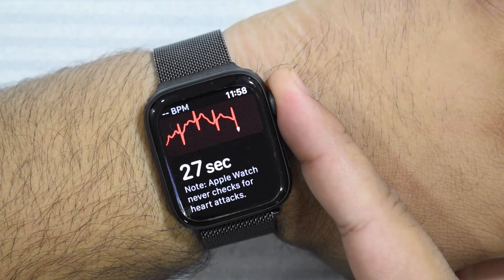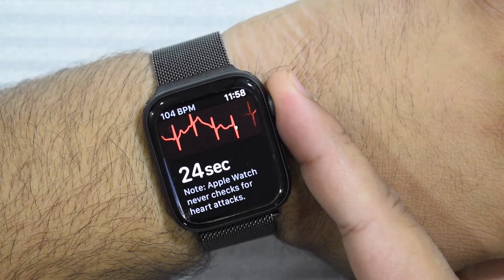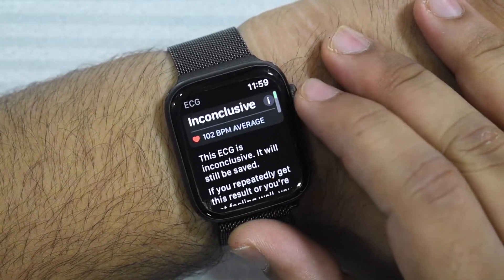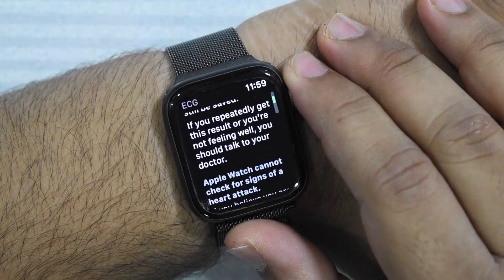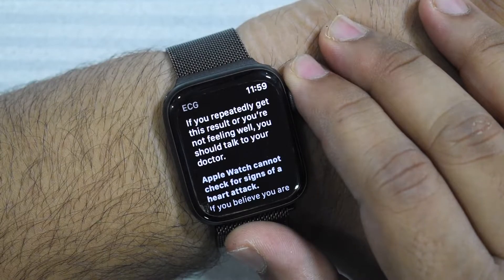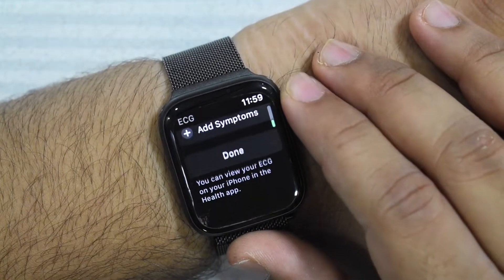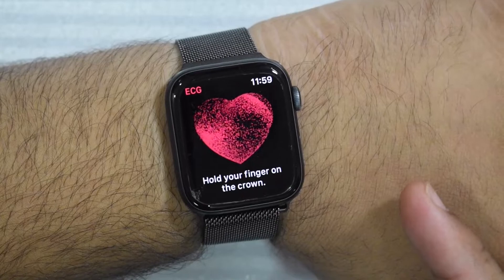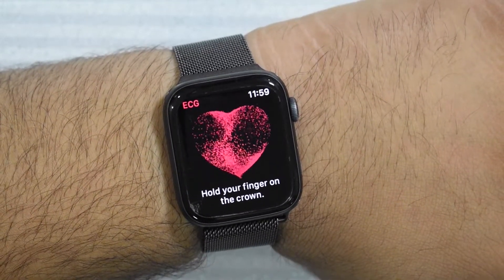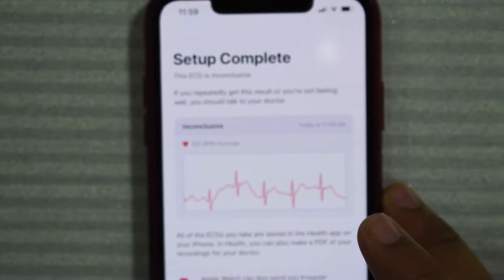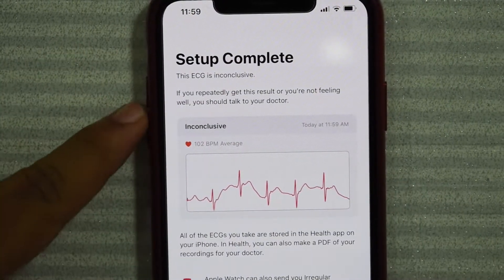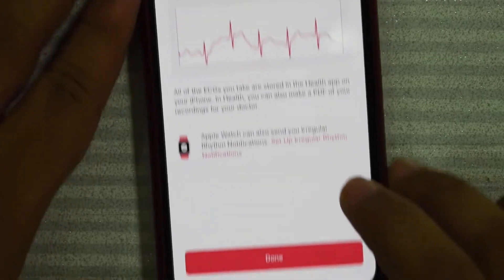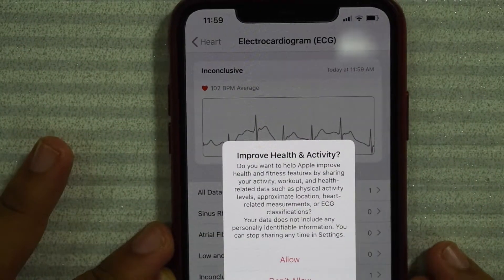Try not to move your arms — 30 seconds. Apple Watch never checks for heart attacks. My result came back inconclusive. This ECG is inconclusive, but it will still be saved. If you repeatedly get this result or you're not feeling well, you should talk to your doctor. On my phone it does say setup complete, and it shows the ECG is inconclusive along with this chart. I'm going to save this for now and try again in a couple of minutes.